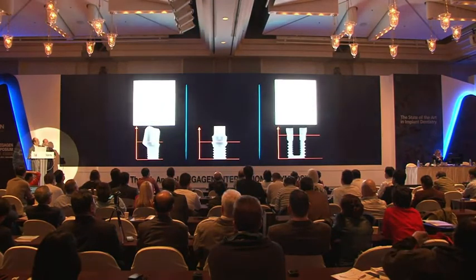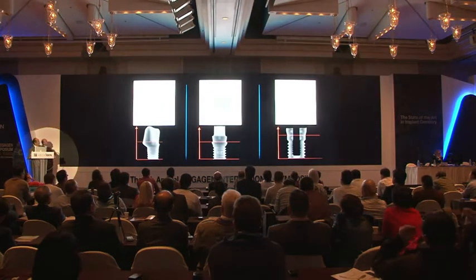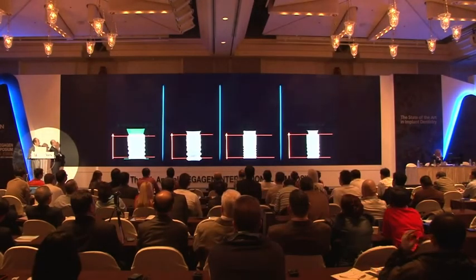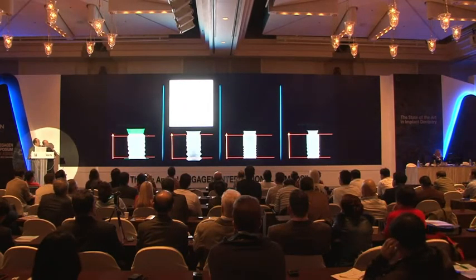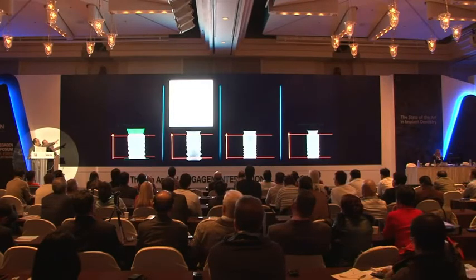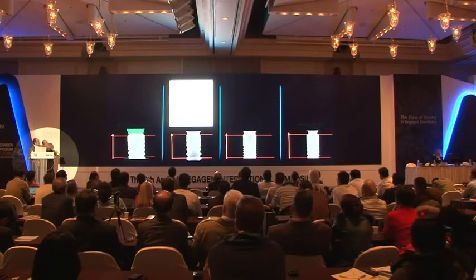All the retention for 3i is on the screw. Things change with conical connection. The first starting is the Nobel Active. We have a space in the bottom of the implant where there is the index, always not working, but when the cone starts, now, for a brief instant it is all gray because we have a contact.